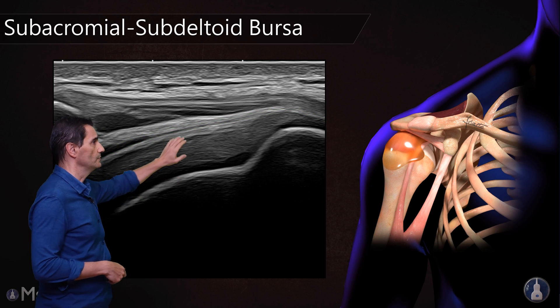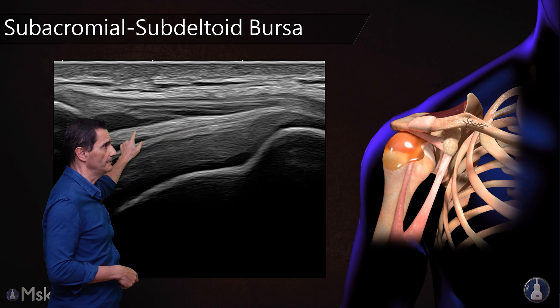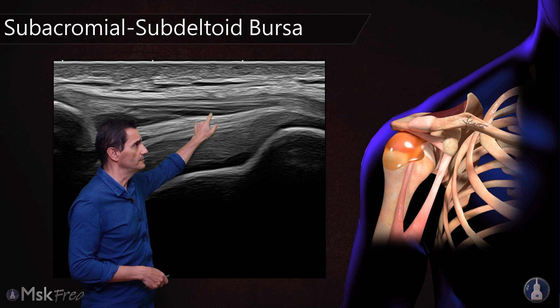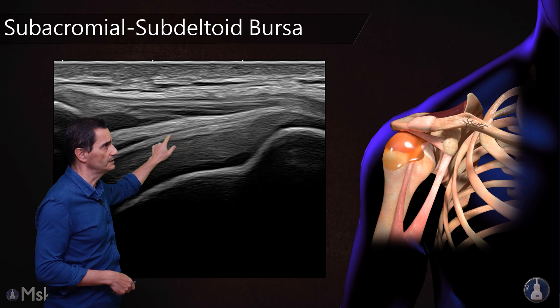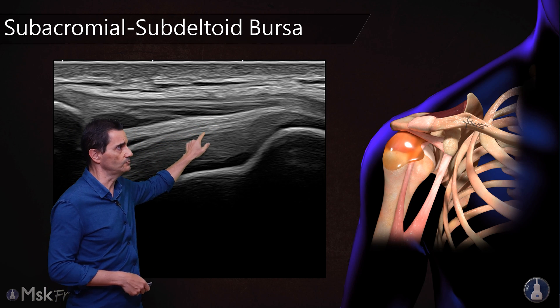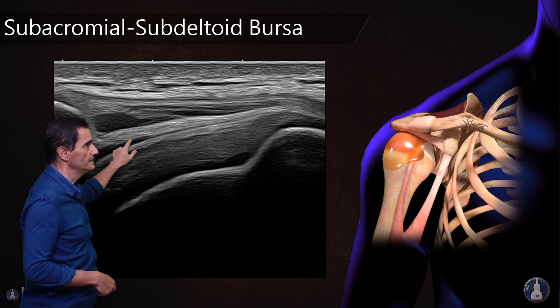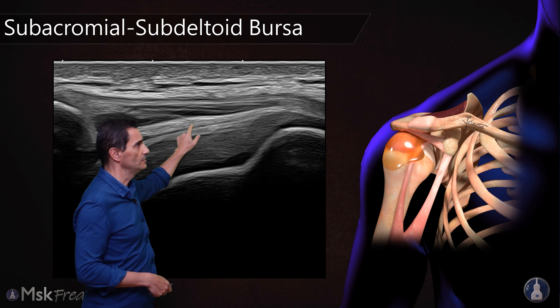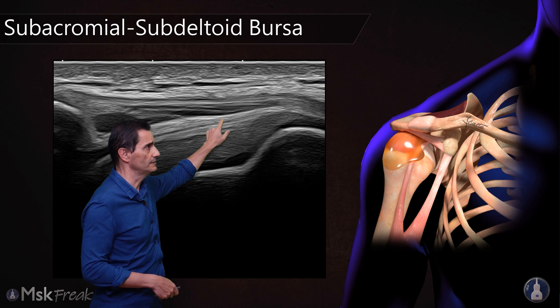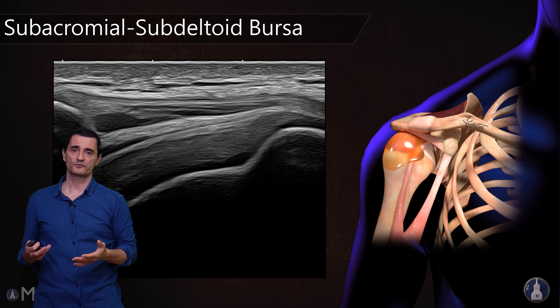The first layer, the superficial layer, will be located in the deep fascia and attached to the deep fascia of the deltoid. The deep layer will be located attached to the supraspinatus, and the content of the bursa will be this very, very thin anechoic line between those hyperechoic lines. This is the content of the normal bursa.